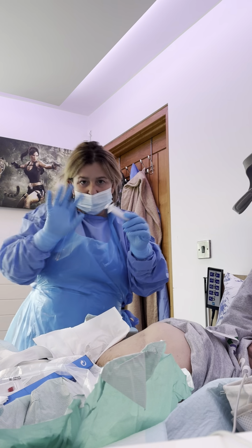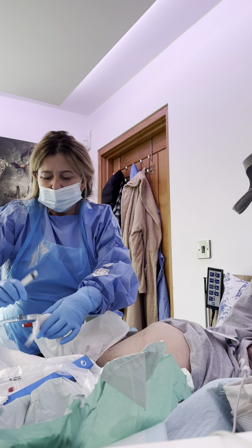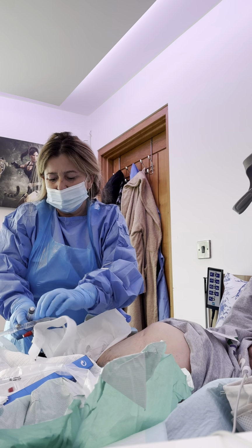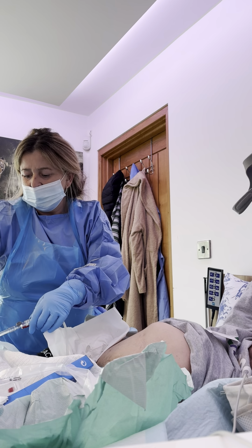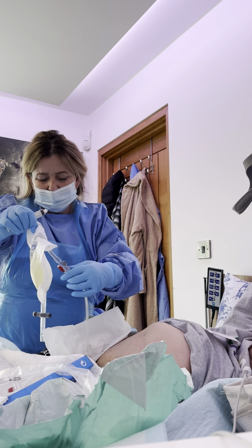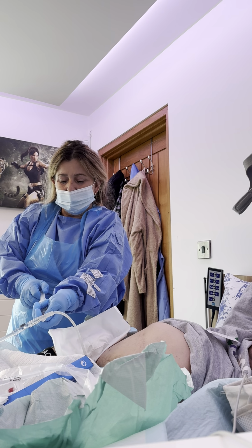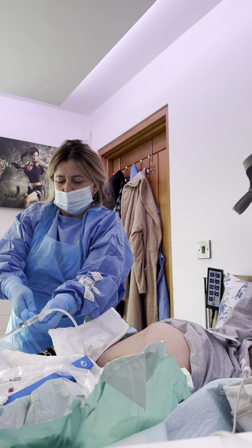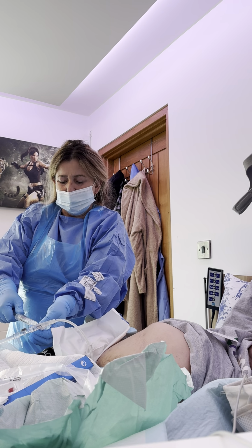You don't need to be sterile, you don't need sterilised gloves for this. I'm going to take the strap off here and get rid of it. I'll pop it to one side because we need that in a minute. Even though I have got a flow and I've done the bladder wash, be really careful. It still needs to come out, so I'm going to draw back really quickly, just to make sure he's not retaining back into his kidneys.